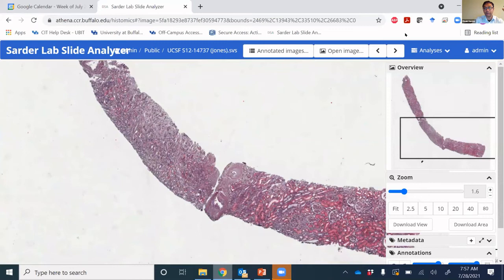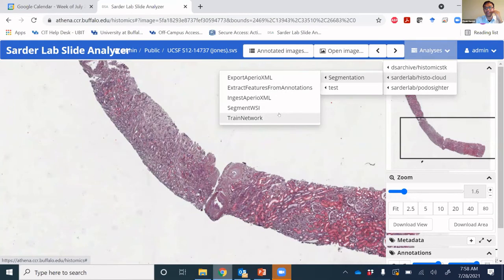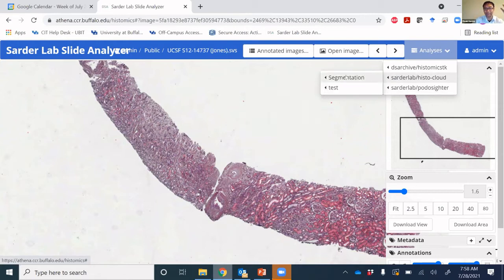So what were our contribution mainly, or really, is adding these plugin buttons for end users. And as you can see, this segmentation button, here are various different operations. We also have other operations, which we are not going to talk about, for cell detection. I will not show the cell detection tool today, which can count all the different cells for a particular cell type. But right now I'm going to show segmentation of structures.